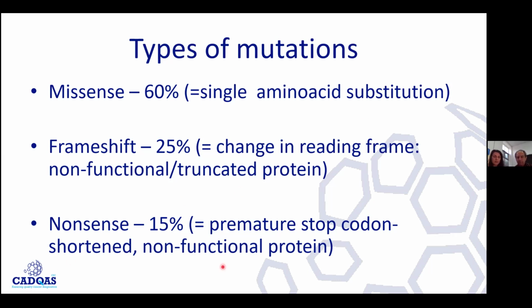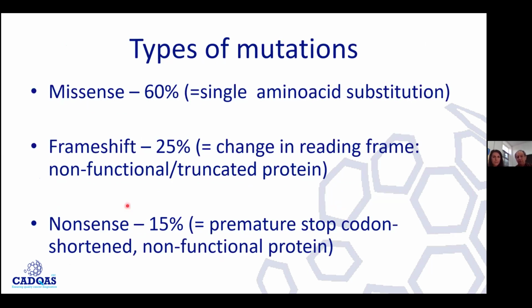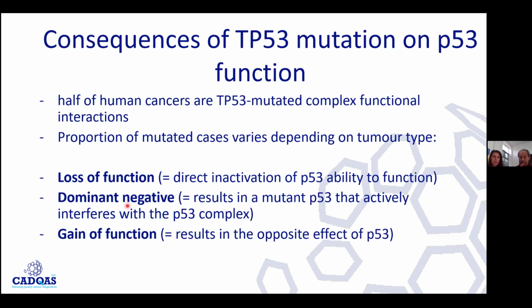So it can lead to either a smaller protein or a non-functional one, so it has all sorts of effects. And nonsense is usually when you have a very small protein that is non-functional, usually associated with no staining. And this is what Corrado was saying previously. Yeah. And also remember that because P53 is a multifunctional protein, some of these mutations may affect one function but not the others. And actually some of them are gain of function as well.